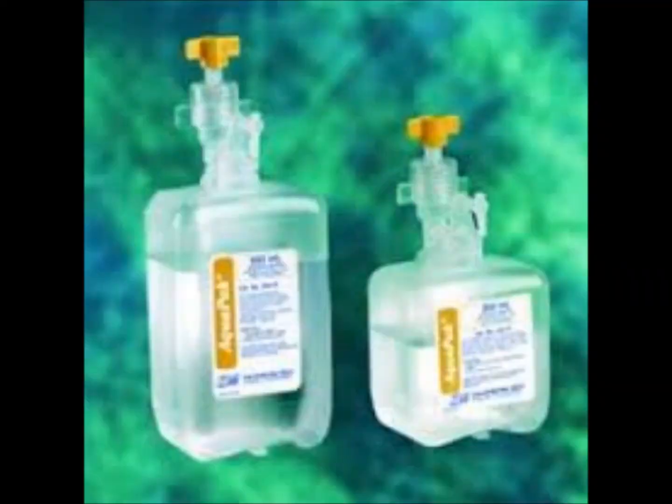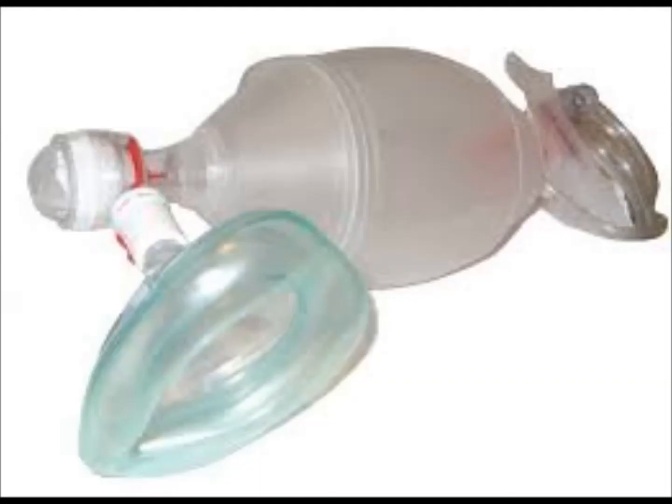Another extremely important item to have for any patient that requires oxygen is humidification. Adding moisture to oxygen helps to prevent the patient's airway from becoming too dry, which always leads to mucus plugs and can block an airway. This is considered a tracheal emergency. This might seem obvious, but ambu bags are extremely important to have at every patient's bedside. It is good to remember how to disconnect the face mask from the ambu bag and connect it directly to the trach.